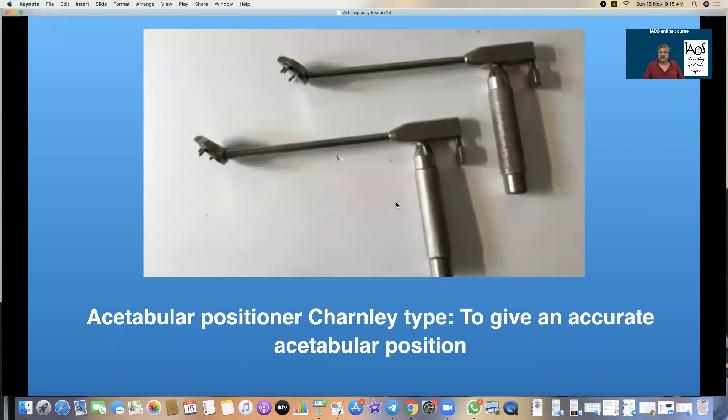This is the original acetabular cup positioner by Charnley. This angle is set at 45 degrees so that it gives the correct inclination of the cup, and by rotating this either anteriorly or posteriorly we can control the anteversion or retroversion of the acetabular cup.